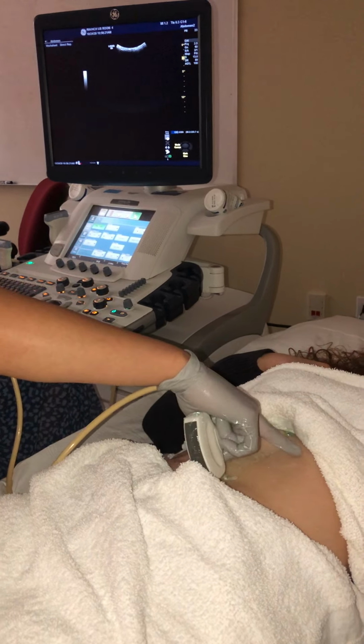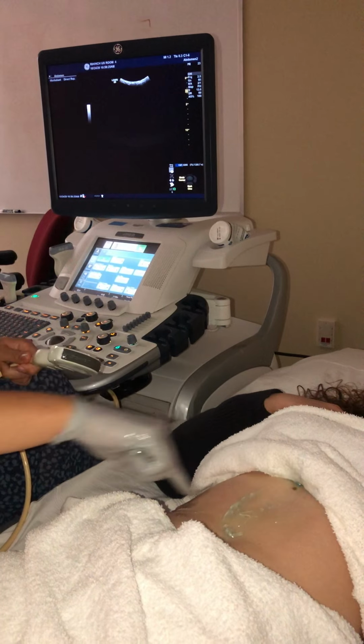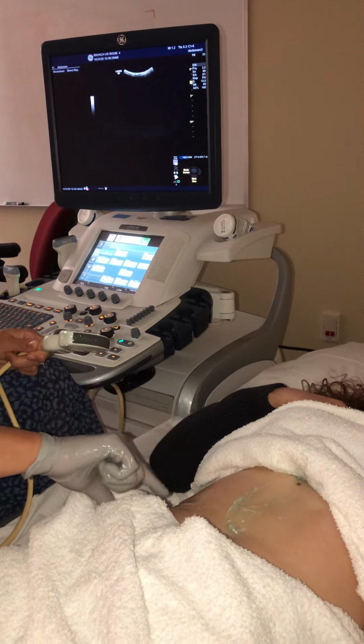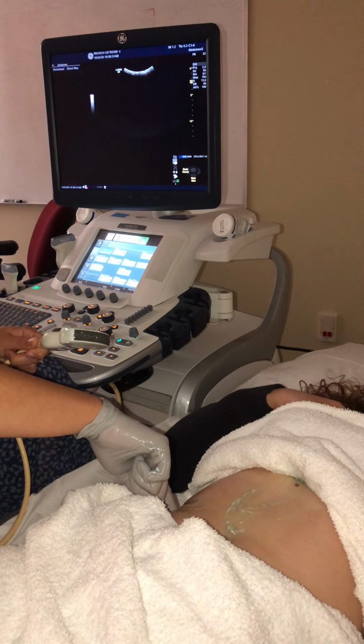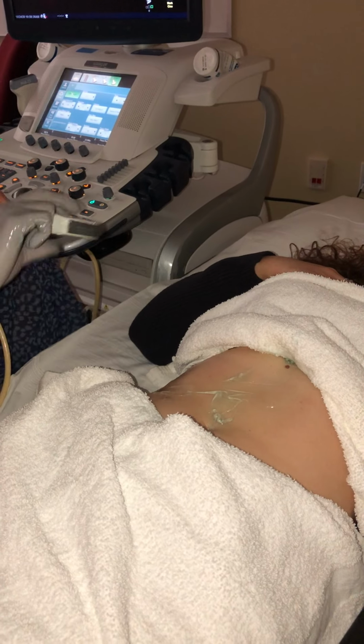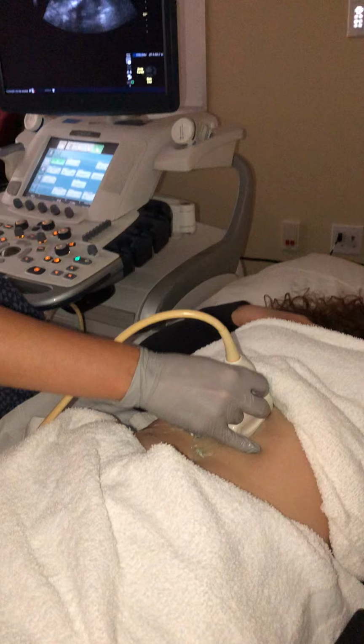Our liver sits in a position like this, right? It's a triangle, and that left lobe is going to start pretty much all the way over here in some people, and that right lobe is going to go all the way down over here in some other people. So it's taking up this entire region of our abdomen. So we're going to be moving around and adjusting our transducer quite a bit to look at this organ.